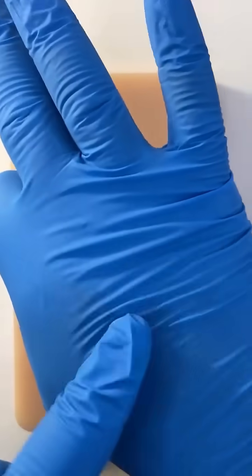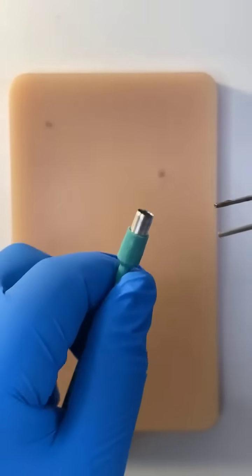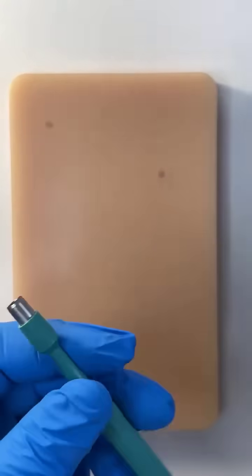So if it's on the back of the hand, for example, the skin is thinner, you don't need to go all the way down. If it's on the thigh or the back, you may want to go all the way down to get a cup of fat.